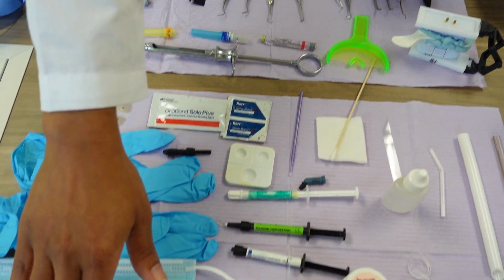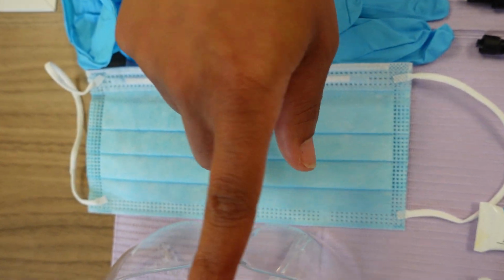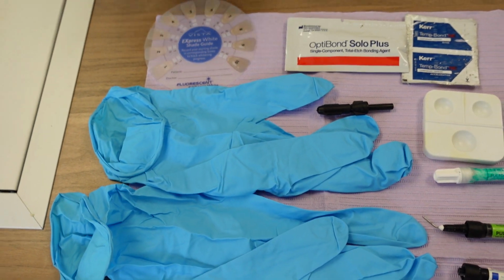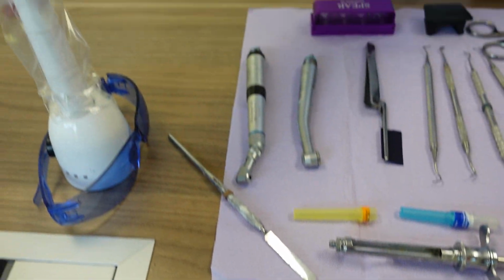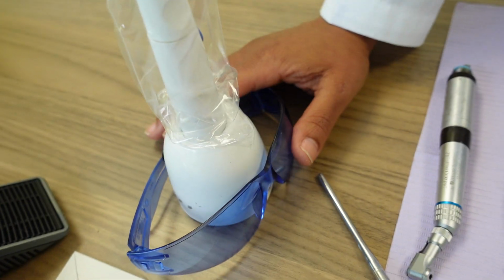Also, we have our PPE. Never go home without it. That is your goggles, your mask, and your gloves. And then also, last but not least, we have our shade guide. And then this is your light curing light, which is also used because if you're doing a core buildup, we use that to light up material.